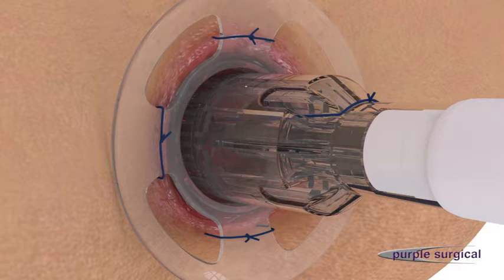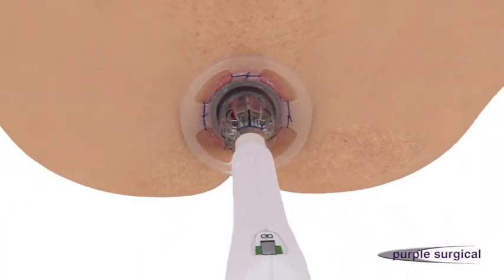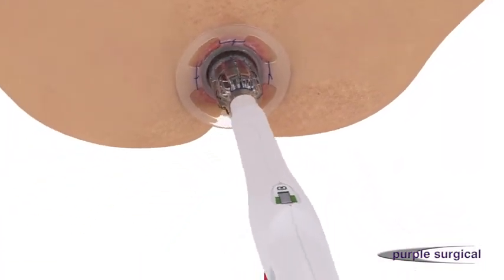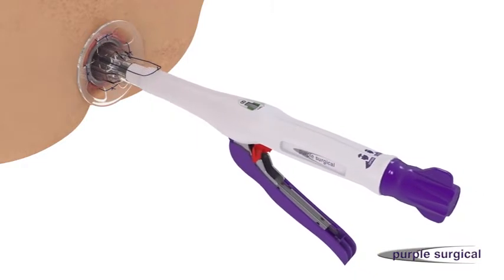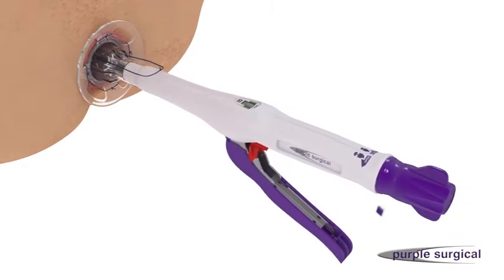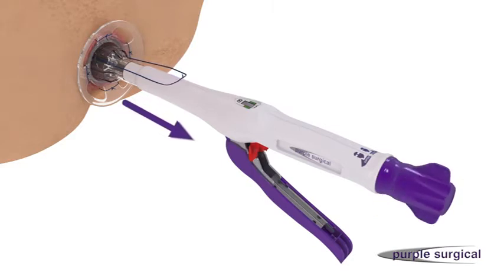Ensure the ultimate hemorrhoidal circular stapler is aligned along the axis of the rectum. Introduce the transparent cartridge into the anal canal and partially close the device by turning the wingnut clockwise whilst gently pulling on the sutures to draw the prolapsed mucosa into the stapler housing.